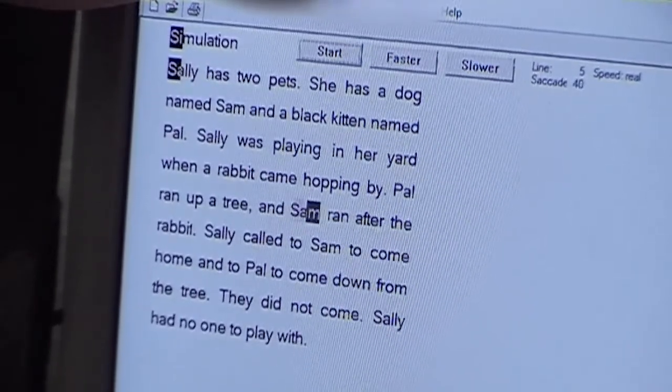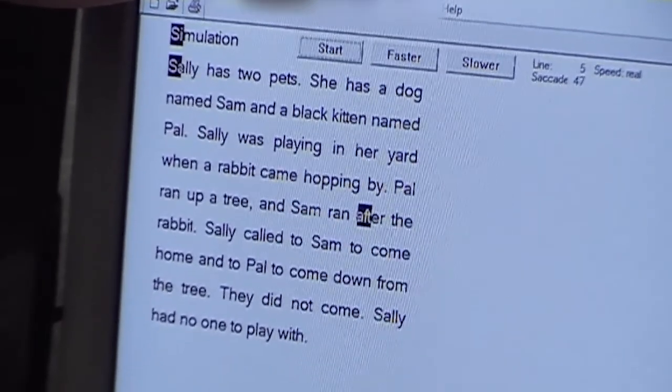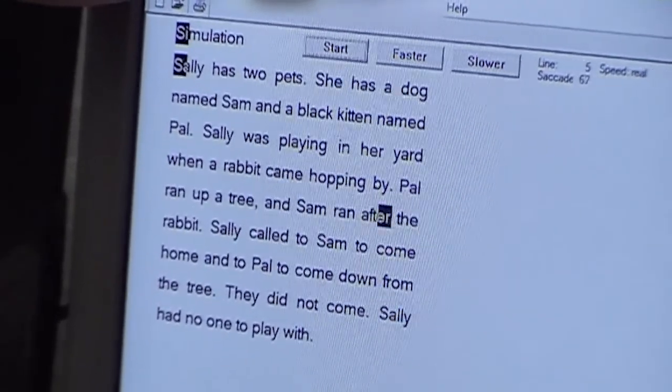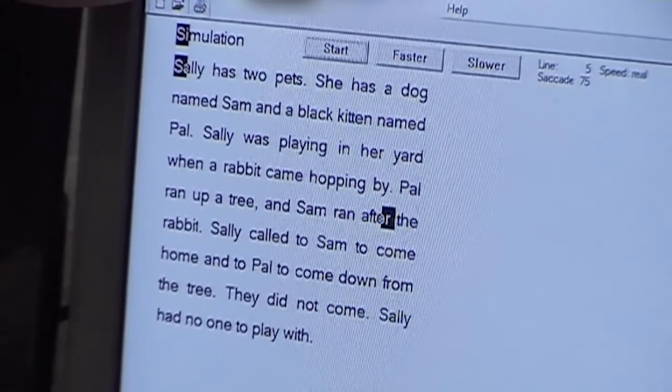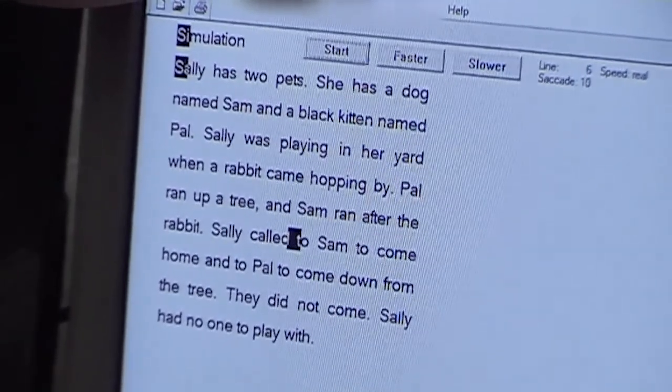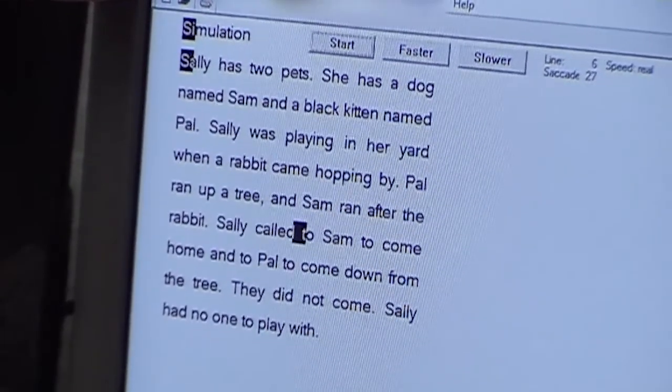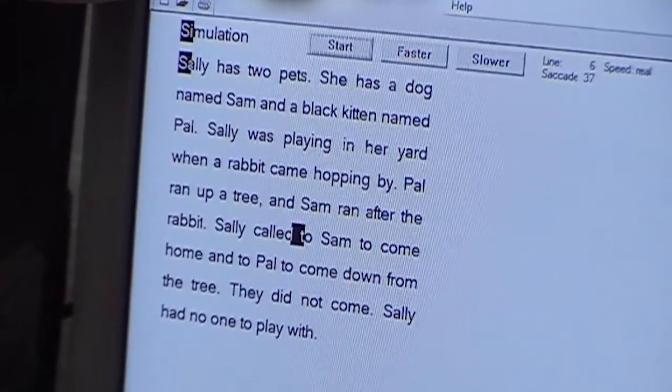Here we're just simply recording them, and this gives parents or patients an understanding of eye movements while reading. You can see how arduous this person is attempting. Instead of going to the beginning of the next line, they've started at the middle of that next line and they're just kind of sitting there.